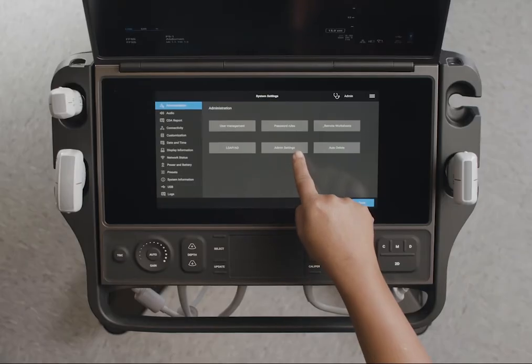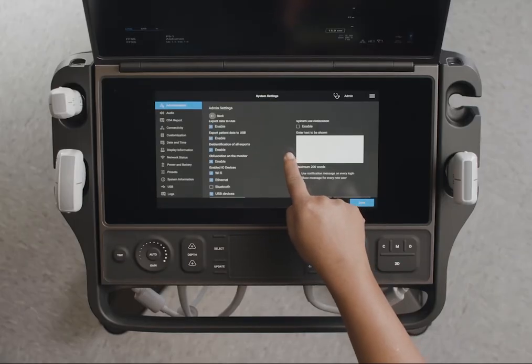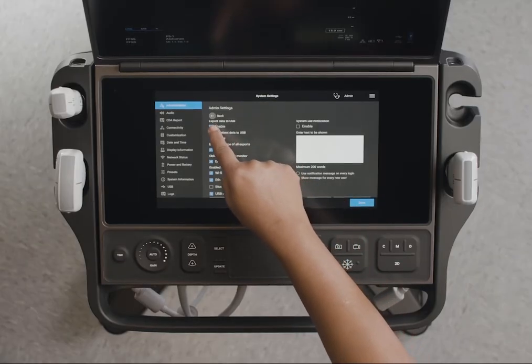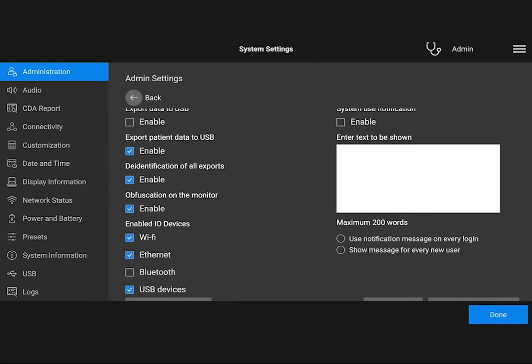As an administrator, you can configure the system to protect patient information by disabling the USB export feature, or by hiding patient information in exported data or on the screen.